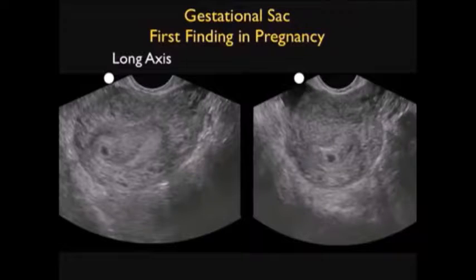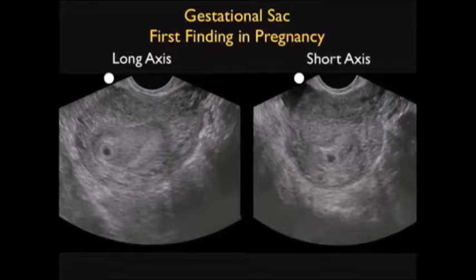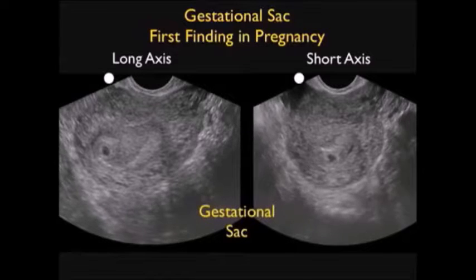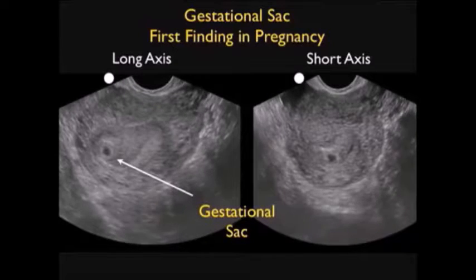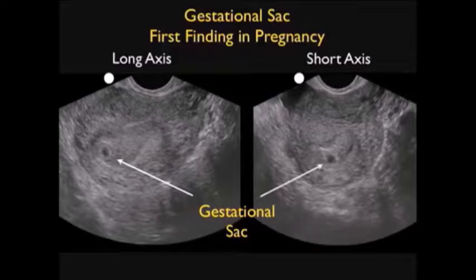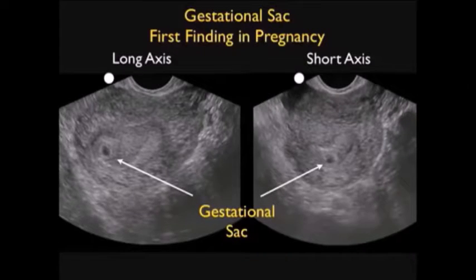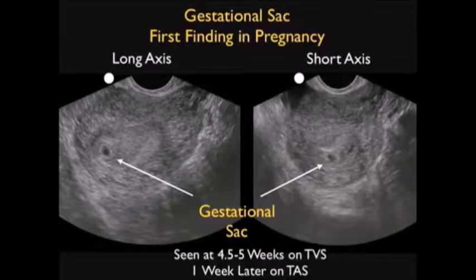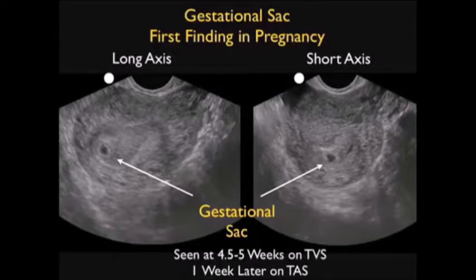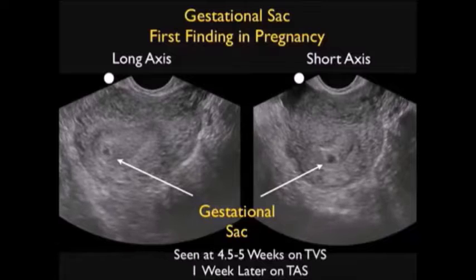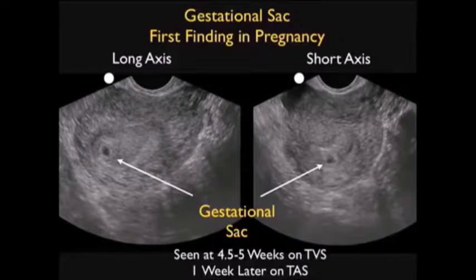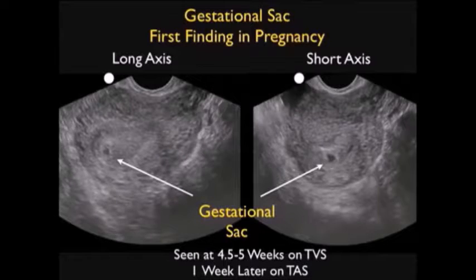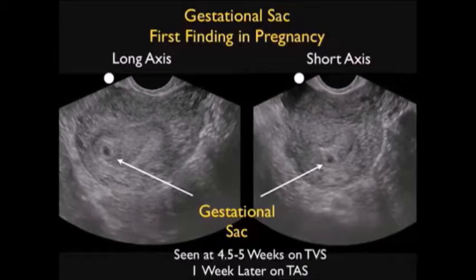Here are two video clips showing the gestational sac in long axis to the left and short axis to the right. We see a very small diameter gestational sac in both orientations. Unfortunately, this appearance can also be seen with a pseudogestational sac of ectopic pregnancy, so a small gestational sac like this is in no way diagnostic of an intrauterine pregnancy. Remember, the gestational sac is seen at about 4.5 to 5 weeks on transvaginal sonography and about a week later on transabdominal sonography.